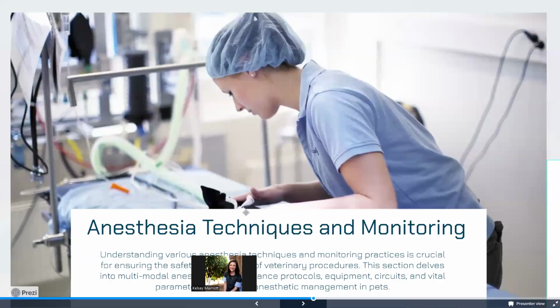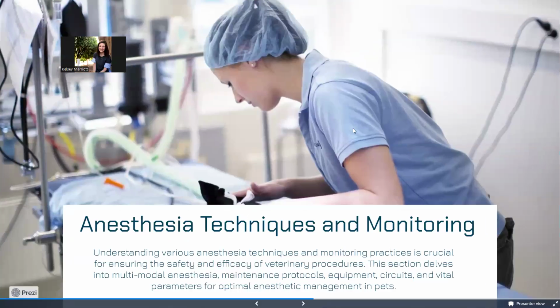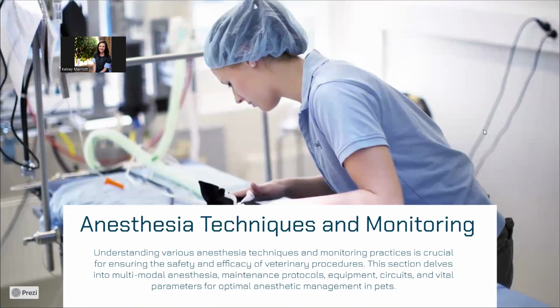So now we'll roll into anesthesia techniques and monitoring. As a technician, this is our crucial role because we want to make sure that we understand the vitals and what they mean and how we interpret them. Is our patient really light? Are they waking up? Are they being responsive to pain? How do we correct that?